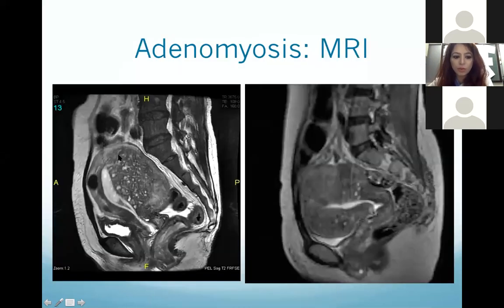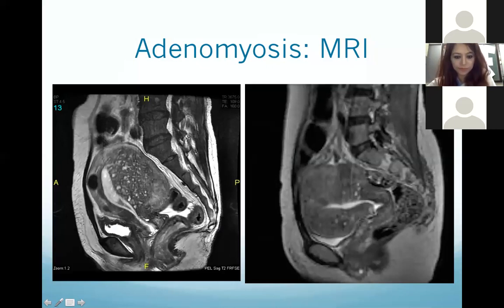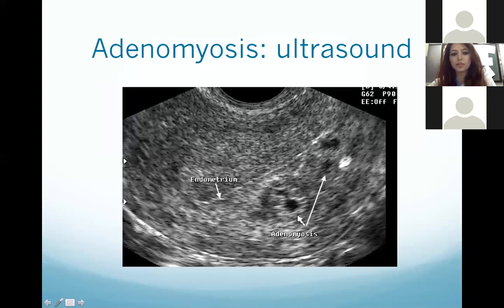This is a case of adenomyosis. You can see a bulky posterior wall of the uterus with little cystic spaces. A fibroid is also noted in the anterior wall. This ultrasound image shows adenomyosis with multiple cystic areas in the posterior myometrium; this is the endometrium.